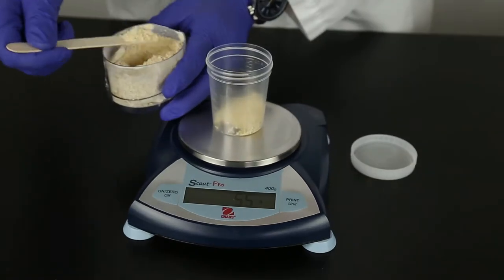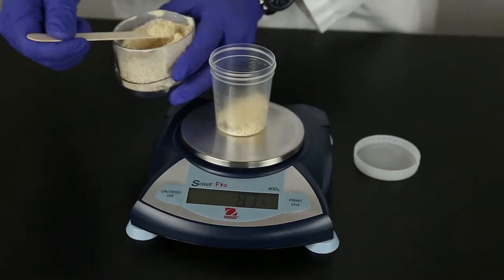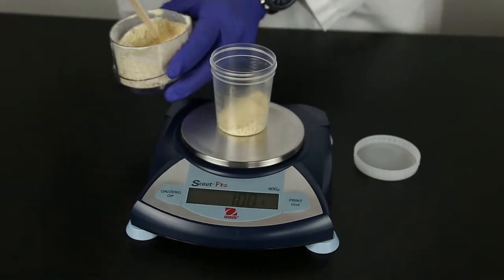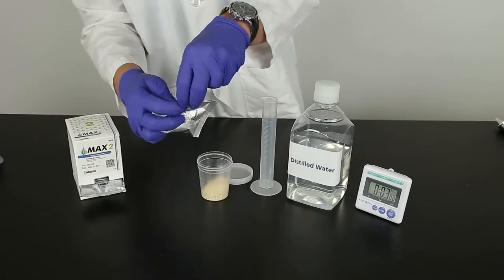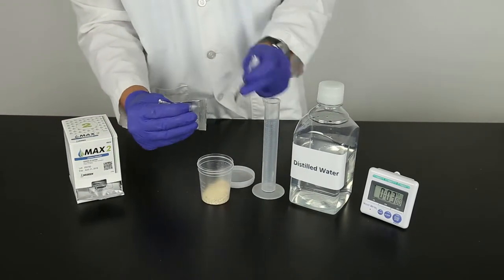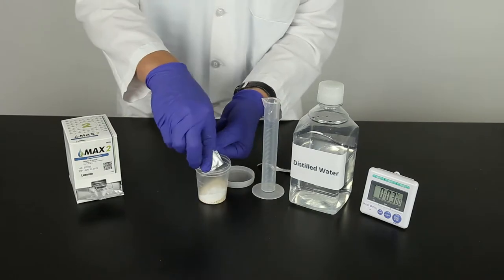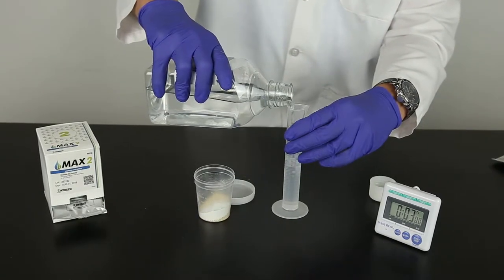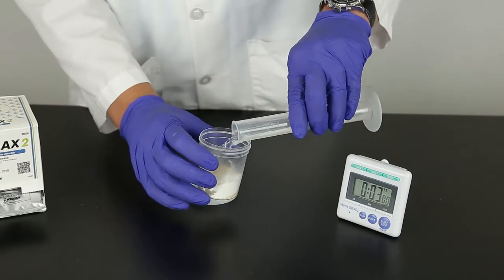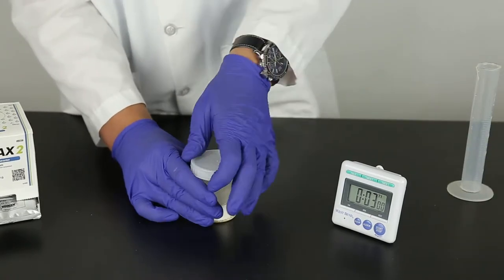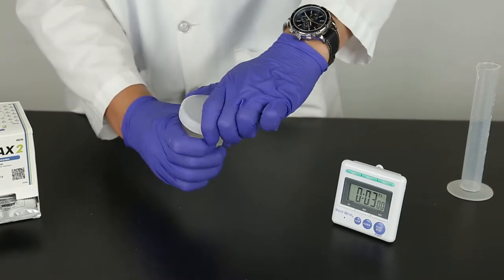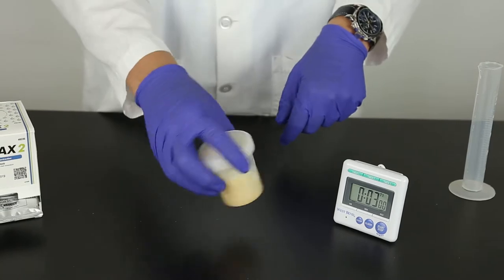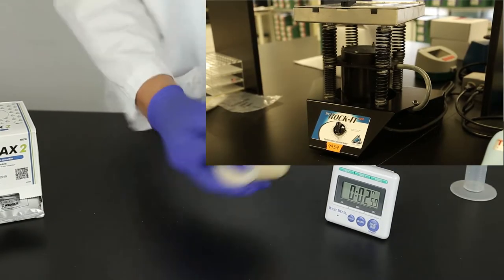Weigh out 10 grams plus or minus 0.1 gram of sample in a sample collection cup. Add the contents of one Max 2 aqueous extraction packet to the cup. Add 50 milliliters of distilled or deionized water to the cup. Cap tightly, then shake to moisten the entire sample. Vigorously shake by hand or mechanical means for three minutes.